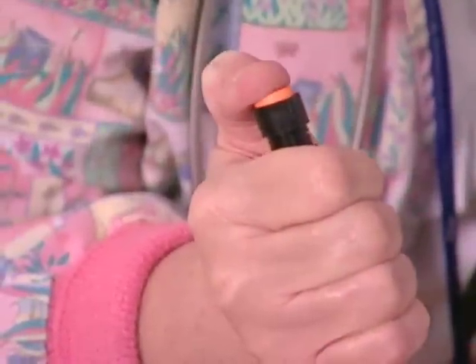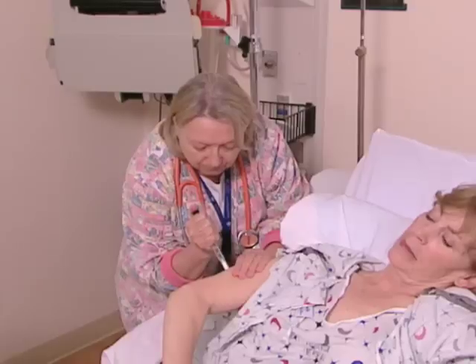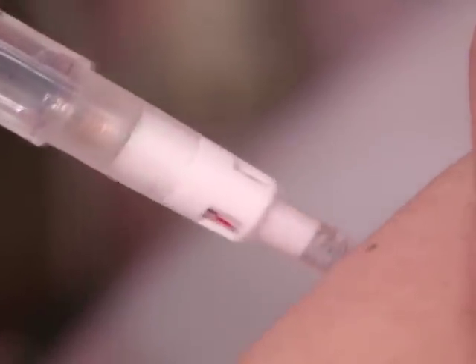Another difficulty is that part of the insulin in the pen may not be delivered. This can happen because the buttons on some pens are difficult to push down, making it easy to accidentally lift the needle out of the skin during the injection. And there can be leakage around the injection site if the needle isn't left in place for at least six seconds after the injection.